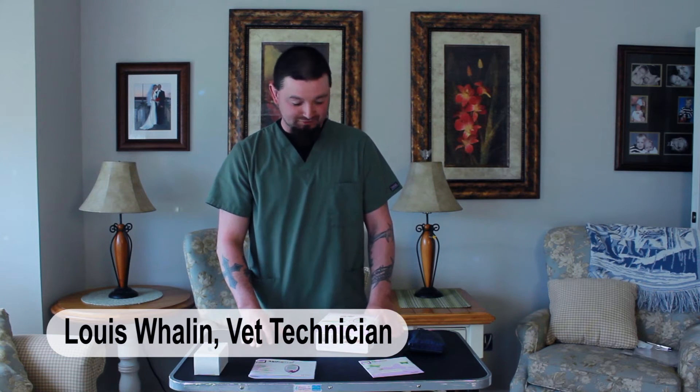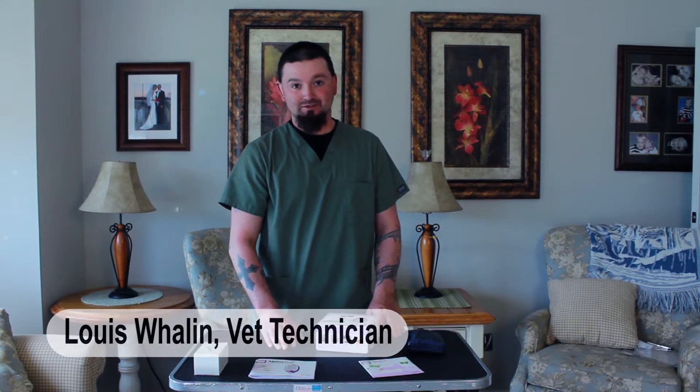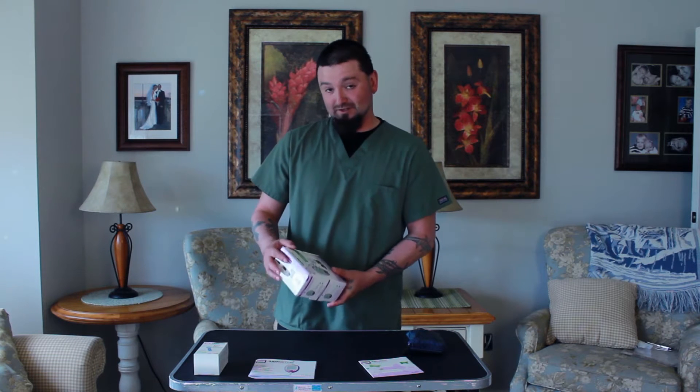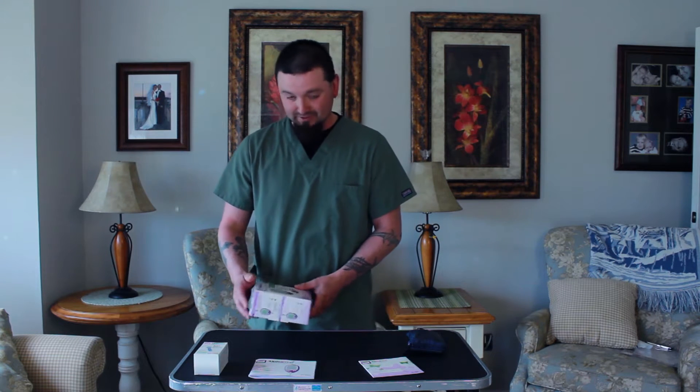My name is Louis, I'm a technician over at House Paws Mobile Veterinary Service and I want to show you how to use your in-home glucose monitoring kit from AlphaTrak. It's important to use a kit that's specific towards animals, not humans. Their values are a little bit different and it can cause some serious problems.